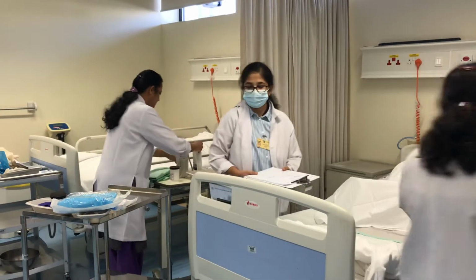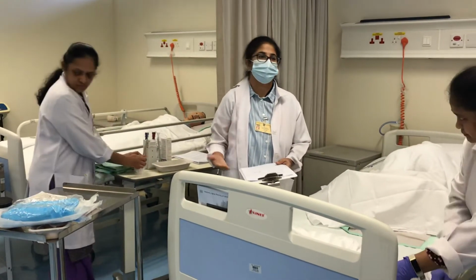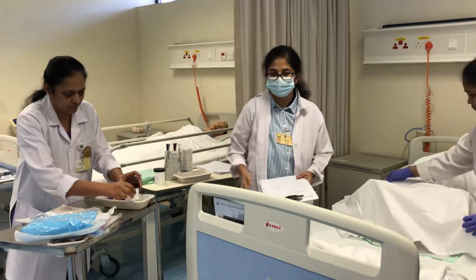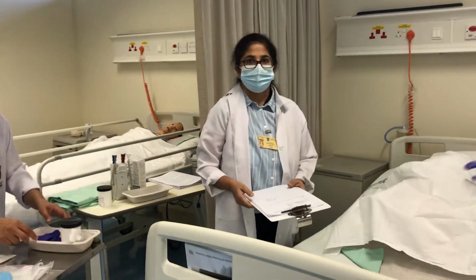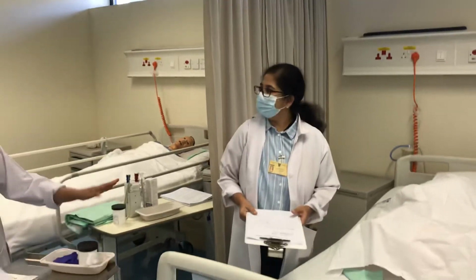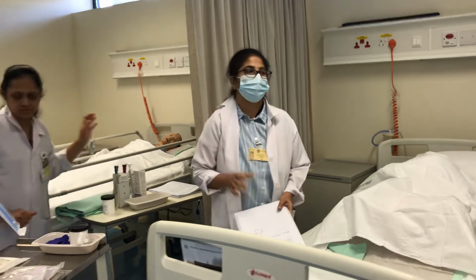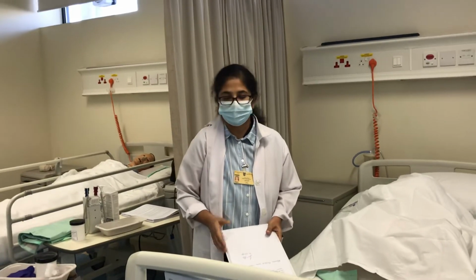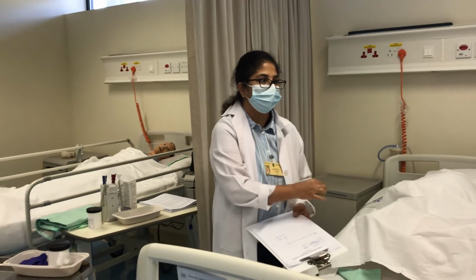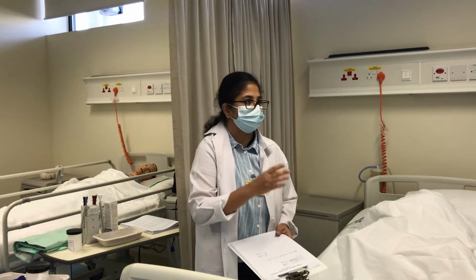Okay, the procedure is urinary catheterization. As we all know, what are the purposes of urinary catheterization? That is to relieve the discomfort due to bladder distension. That is one of the main purposes of catheterization. Then also, if you want to know clearly the amount of the residual urine, and also if you want to get a sterile urine sample directly from the bladder. So these are some of the common ways.